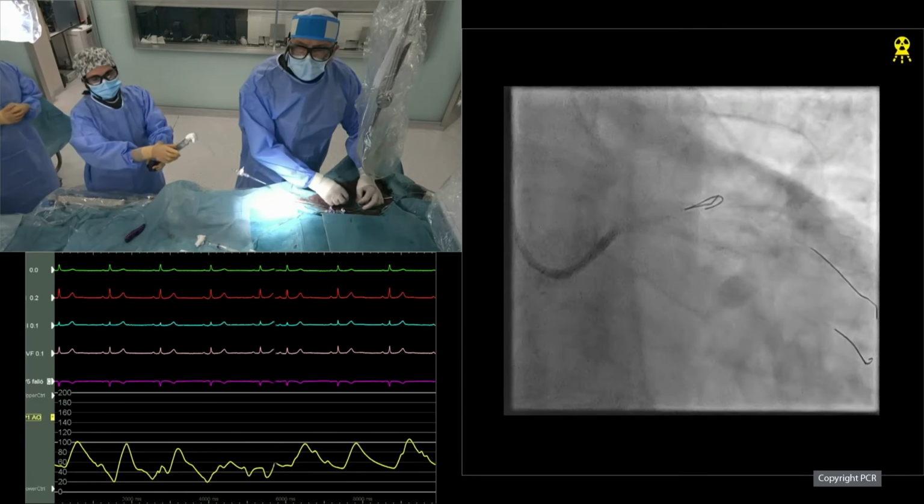It's in a big diagonal. We are not going to struggle to put it in the true LAD, because with this distortion of the distal part it is okay. For what we want to do now, we believe it is more than enough. So that's basically what you were probably seeing while we were following your nice discussion.